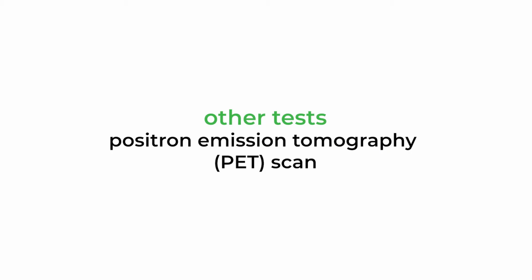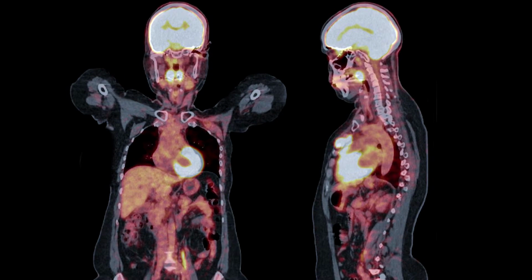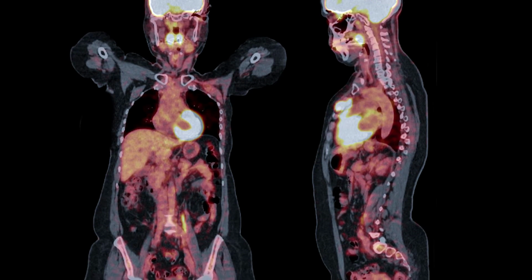And then you can also consider doing a positron emission tomography scan. That is called a PET scan. And what a PET scan measures are a couple of different things. One is metabolic activity in various places in the body. And typically in myeloma, you're looking for areas that have increased metabolic activity over normal, primarily in bones. You're looking for asymmetry because that can certainly signal somebody has myeloma. That means that there aren't symmetrical changes in the bones one side to another. There's a CAT scan that's included in this, so you can look for actual lytic lesions as well.